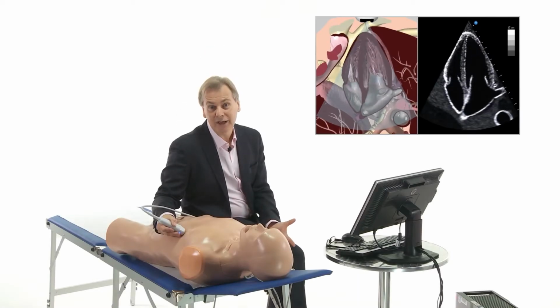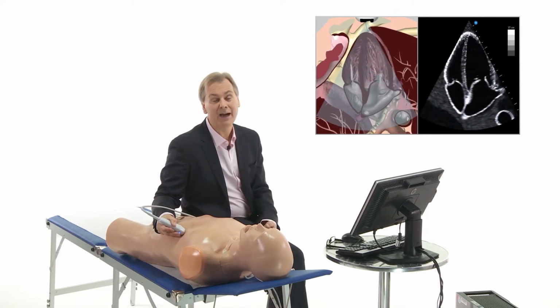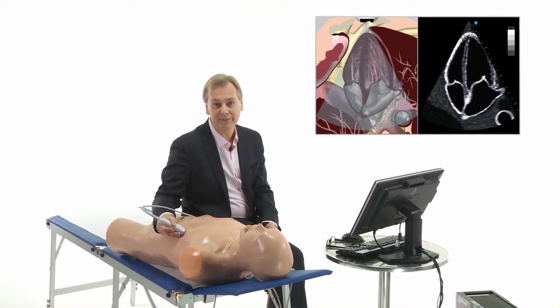So remember, foreshortening for the ventricle, but for the valves, who cares? But we are not done yet with the four-chamber view. Thomas is going to show us some more structures. So you're all familiar now with the four-chamber view, but I want to show you some additional things that you might not have known. There is more anatomy to show.